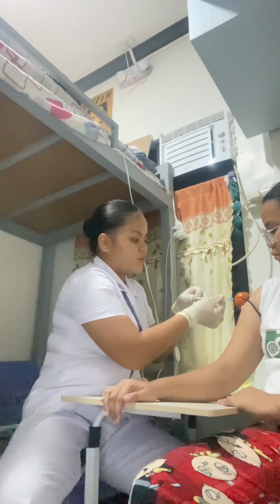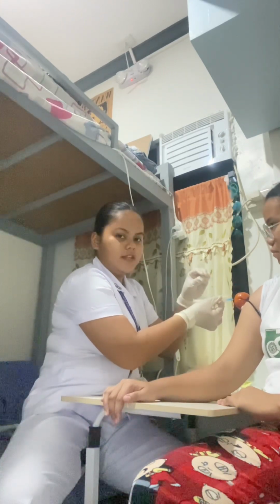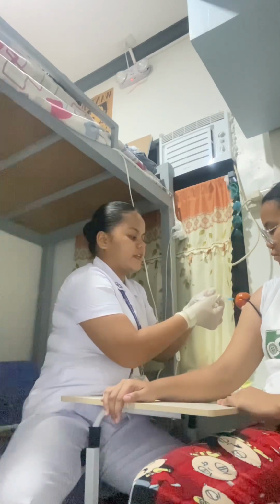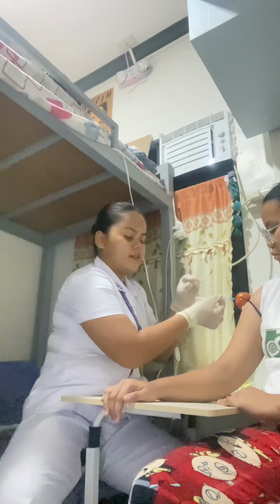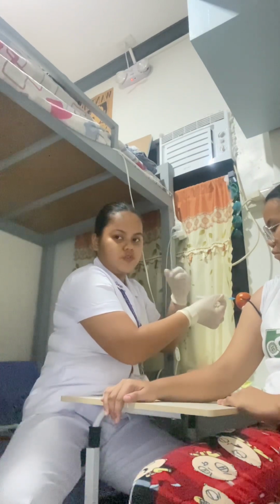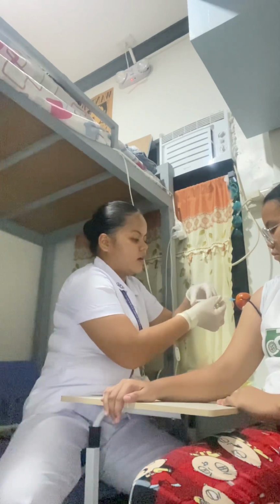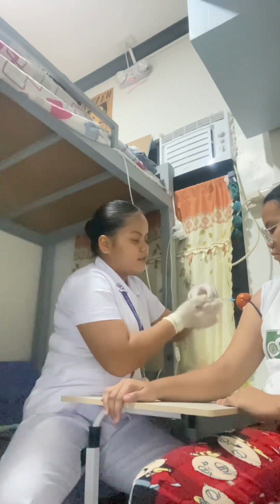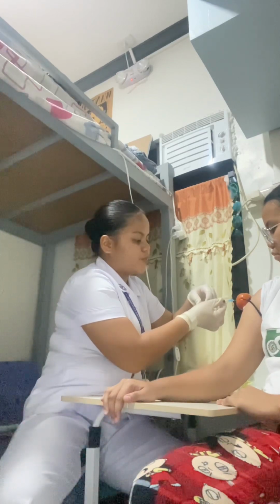Aspirating the syringe will help to make sure that the needle is not in a blood vessel, or that the bevel of the needle is not touching any blood vessel. So aspirate it. If no blood is seen during the aspiration, I'm going to inject the medicine. If blood is seen during the aspiration, we have to withdraw the needle and prepare a new syringe.